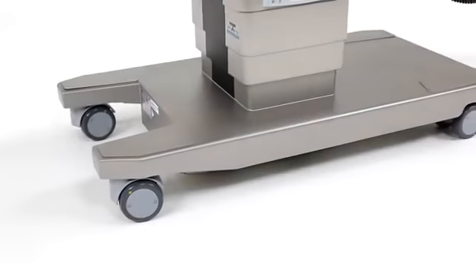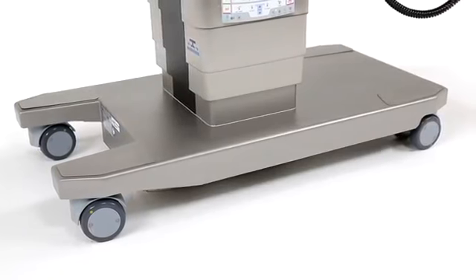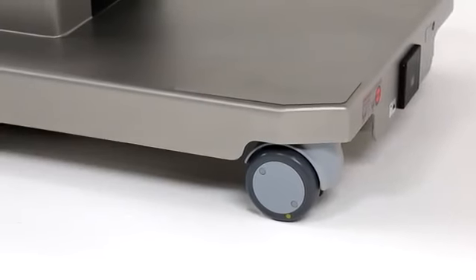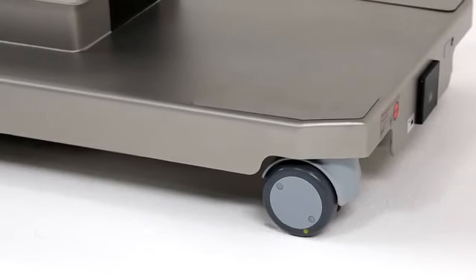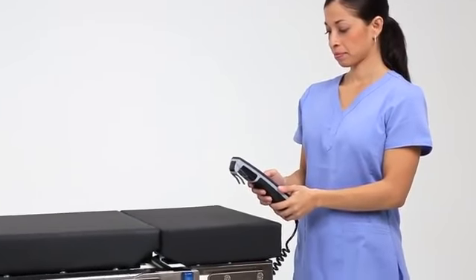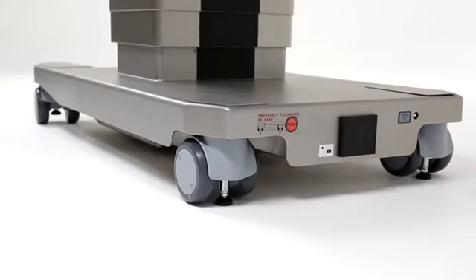From the ground up, the TruSystem 7000 was designed to deliver meaningful innovations that help hospitals care for patients, not struggle with difficult equipment. Larger, low-friction wheels were custom designed to improve mobility and withstand heavy use in an OR setting. The floor locks are positioned at the farthest corners of the base, giving the table the most solid foundation possible.